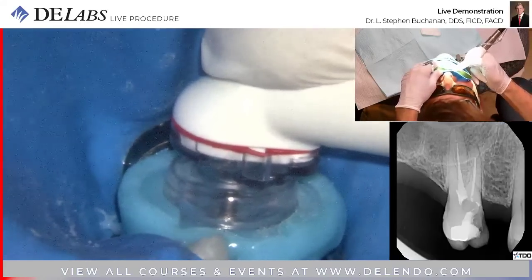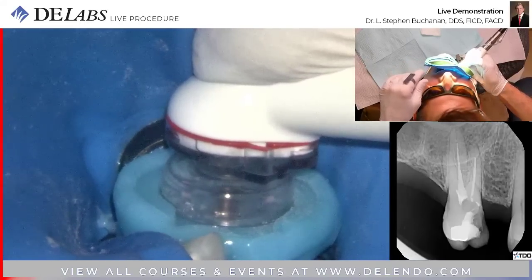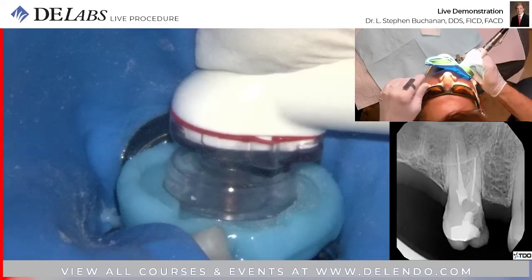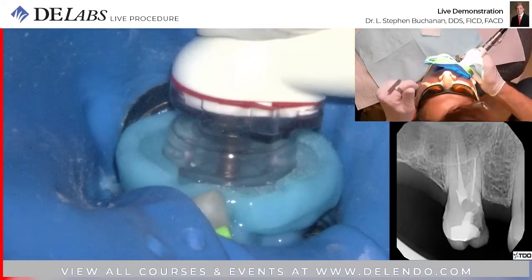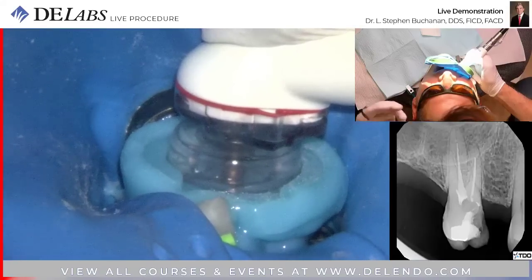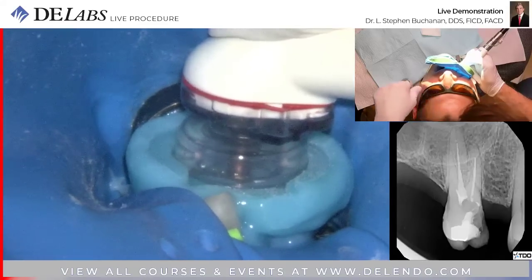Okay, the first part of this is going to do a 1 or 2 minute test to see if there is a seal. We want to see that there's no air bubbles in there. That initial... looked like it was sparkling water in there. That's not good because that means we're getting air in under the maybe the mesial wall that's missing.